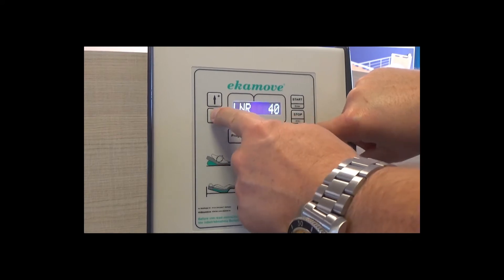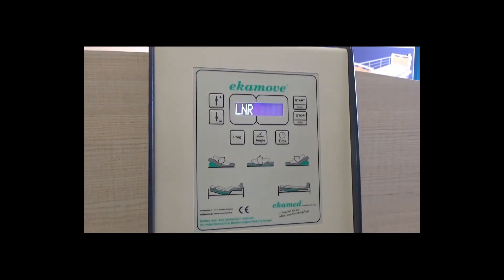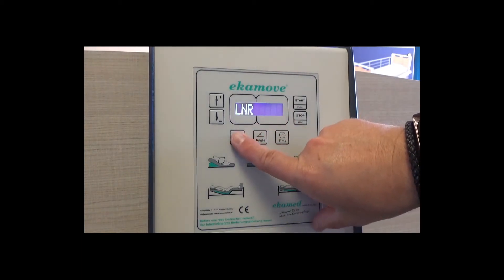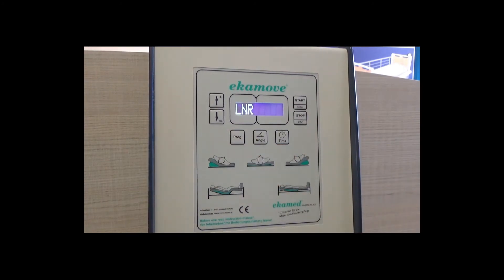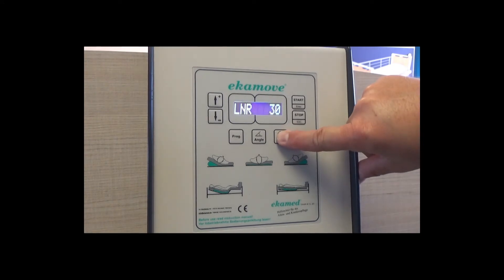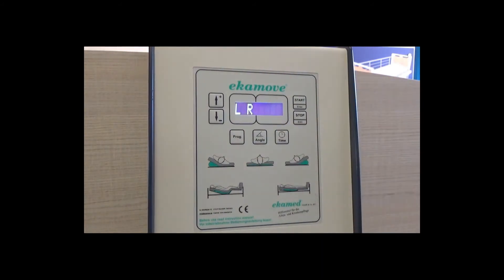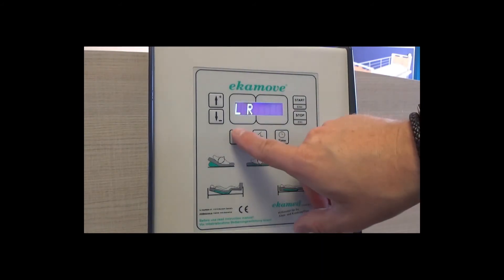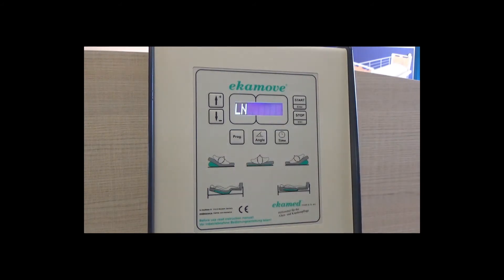When using P5, program the left and right angles and left and right dwell times individually. To do this, press and hold the program button and when the L starts flashing, set to the desired angle and dwell time. Once complete, press the program button again and the N will start flashing and the dwell time should be set. Repeat the process on the right side, setting the angle and dwell time.